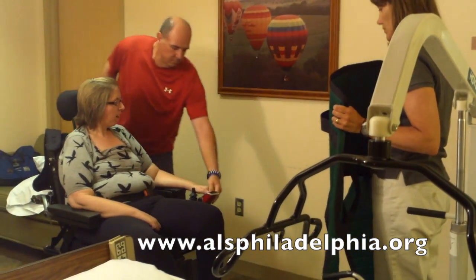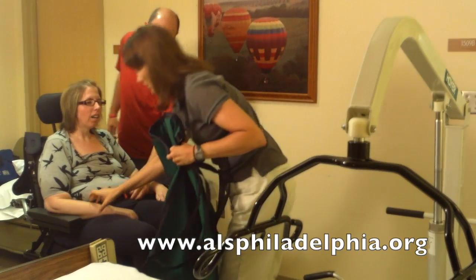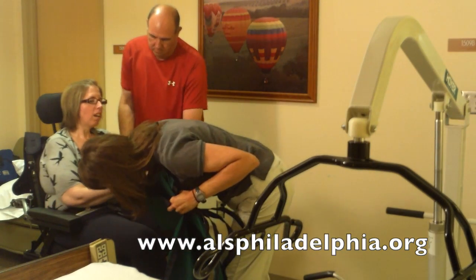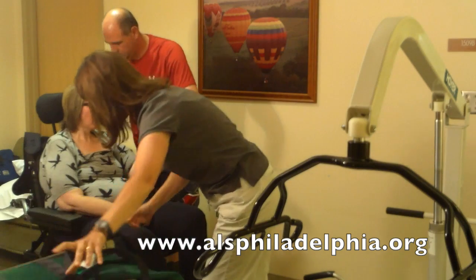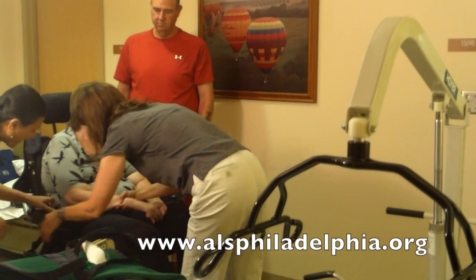You may need to lock your chair so it doesn't move. Both arms to be kept on your knees for stability, and make sure your seatbelt is off.